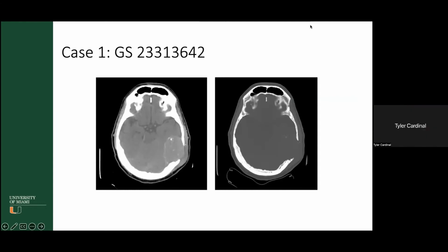Sure. So it looks to be a hyperdense region in the left temporal, like mid-temporal region, that has some contrast enhancing areas. So this is a plain CT. There's no contrast here. Oh, gotcha. Okay, sorry. So it's just mixed densities.